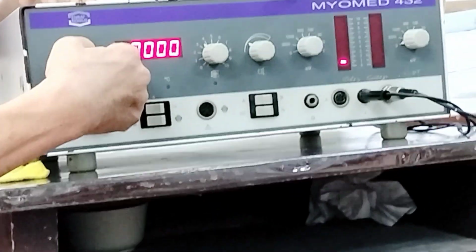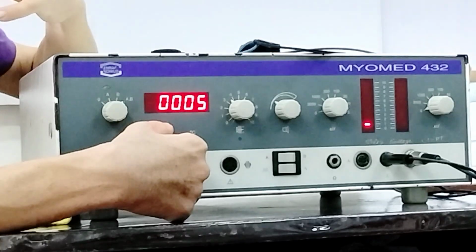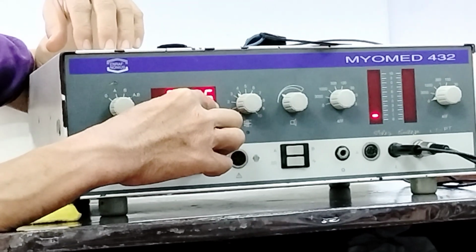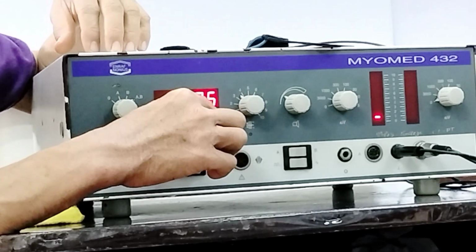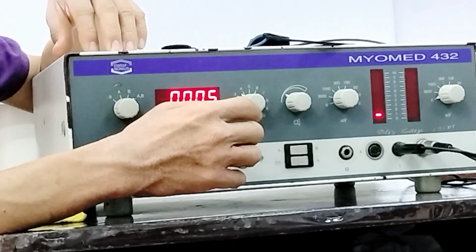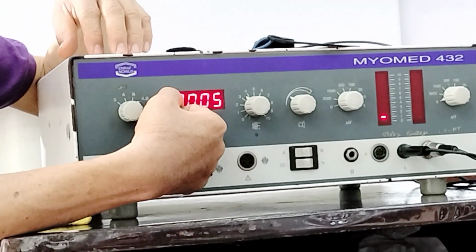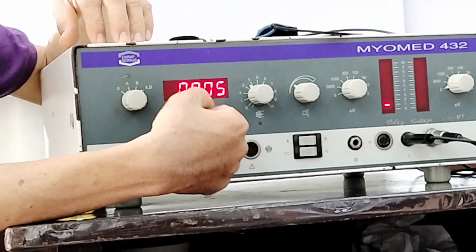And further to the right most is AB, so it now gets a signal from both channels, but what will appear there is the difference between the 2 channels. If you have 5 here, it means the difference between channel A and B is 5. And if channel B is greater, a horizontal bar will appear.